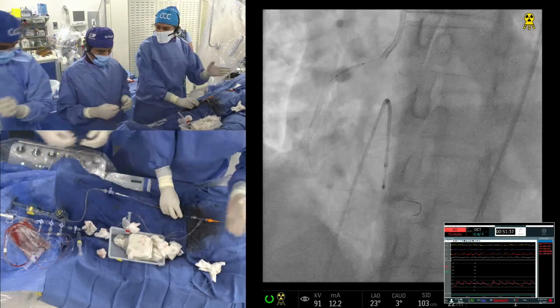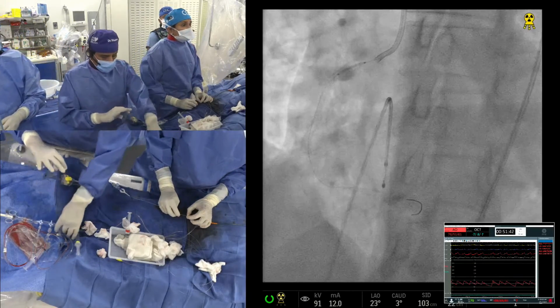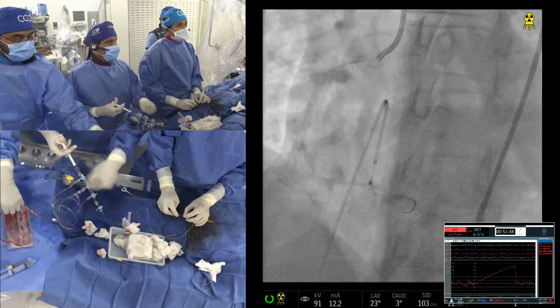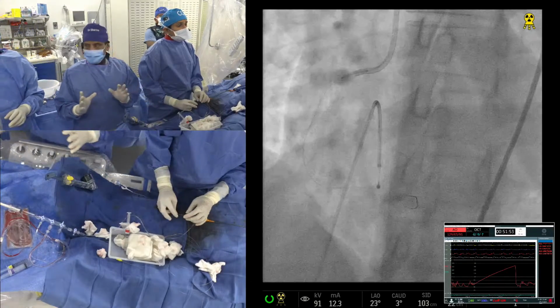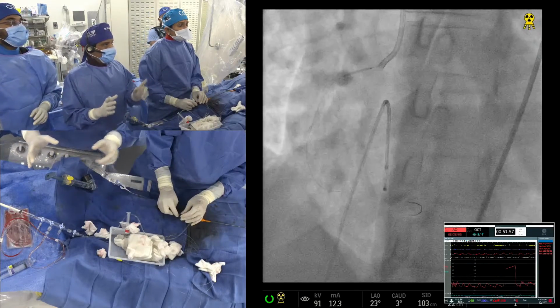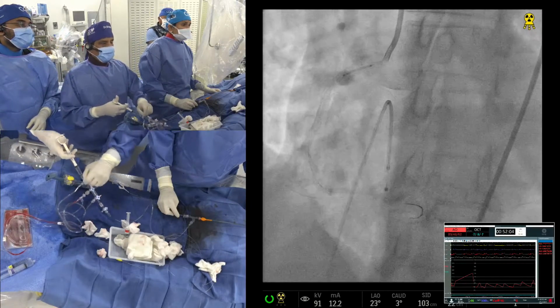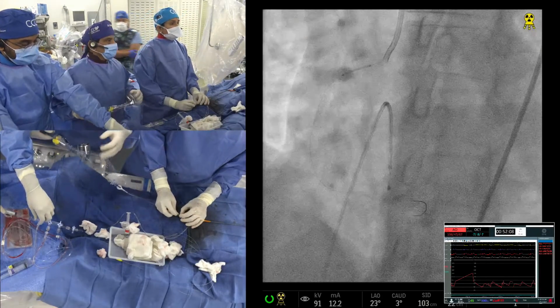Yeah, but we saw slow flow after rotational atherectomy, more so. So this is the lipid and no lipid. Remember that still, by and large, the mechanism of slow flow in this patient is all that calcium. Even if there was no lipid, this was expected. The only question was, since our OCT did not cross, should we have used a 1.25 burr? I'm telling you one little more bold statement. Ready? No, 1.25 would not have done much.